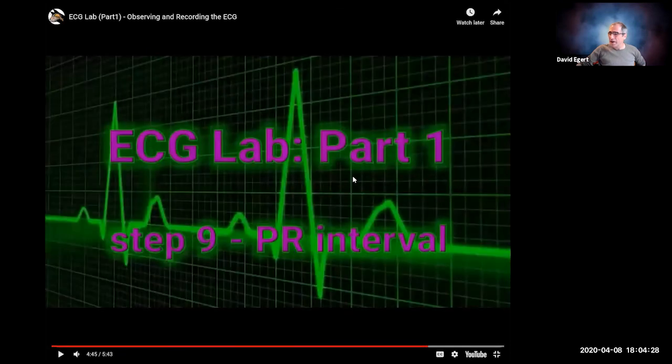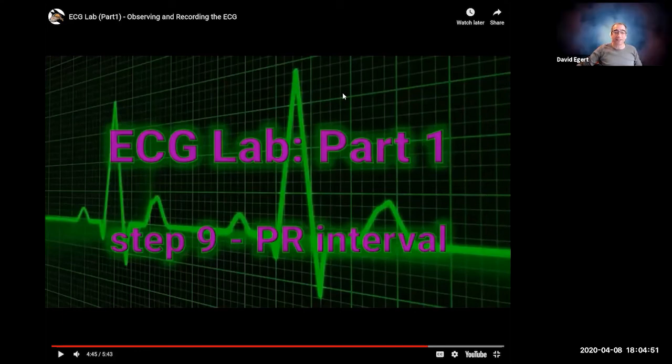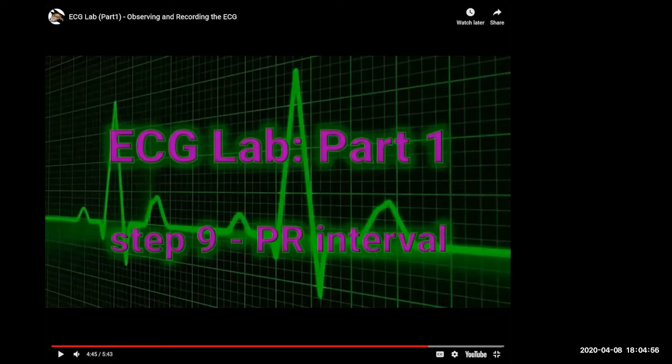All right, so what happened there? You could see, obviously it all got totally crazy, but why? What was happening? Why did it look all crazy? Is that temporal summation? No. I think the electrodes were picking up the electrical signals from the sarcolemma as well as the heart?